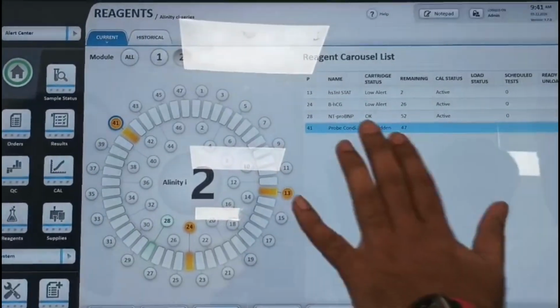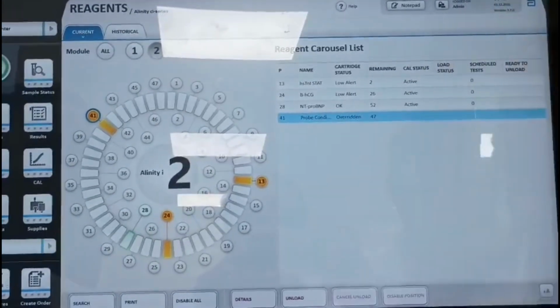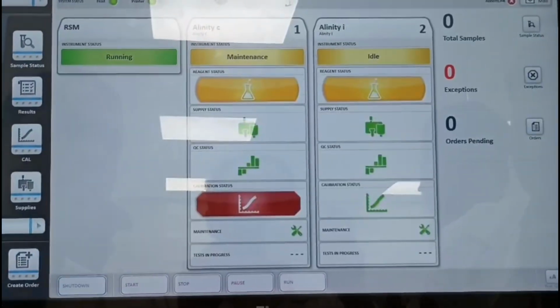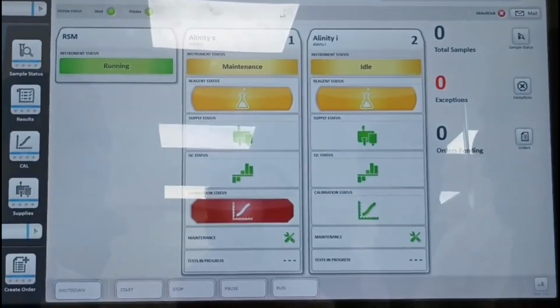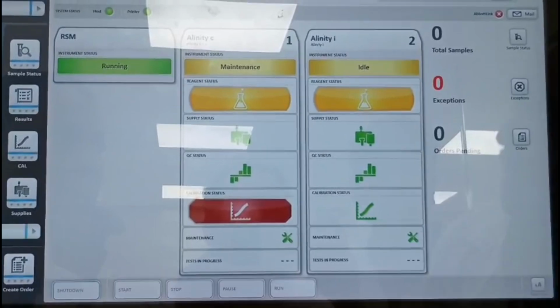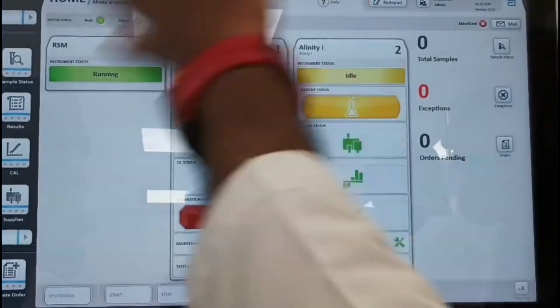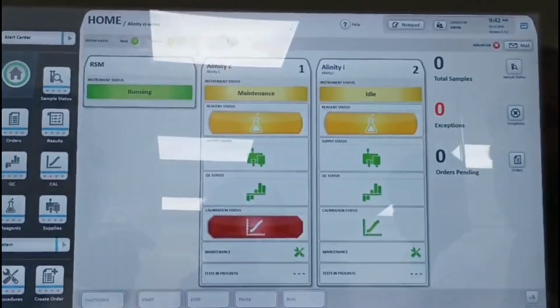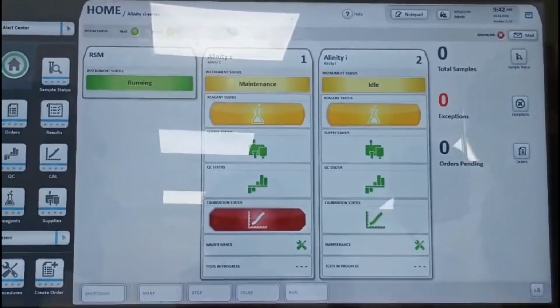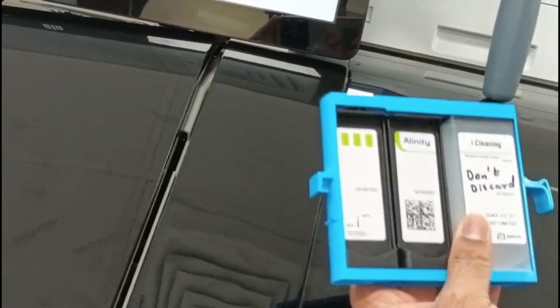Yeah. So not maintenance reagent, just probe cleaner only. Purpose all probe cleaner. Okay? Every day you can check below, so now you can start maintenance. Okay? But this machine does not have maintenance reagent inside. Every day we prepare, then load. Manually it should be loaded for maintenance reagent. This chemistry machine already has everything inside. You understand? This one, every day you can prepare then load. Okay? So now you can start maintenance reagent. No, first you can prepare the maintenance reagent. Okay? Probe cleaner, immunoassay. So don't discard this one. Discard.